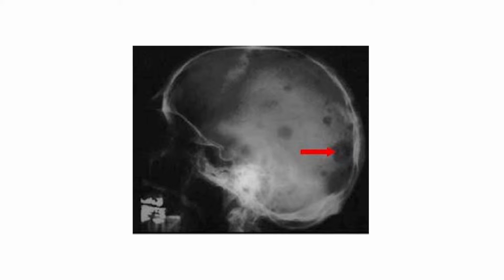So many years ago, bone survey, as it's called, or skeletal survey, was incorporated as a part of a way to see if somebody had myeloma or not. So we still do that test, and I think sometimes this is very scary for patients, part of the reason we are interested in looking at the skull is because there is a very large expanse of bone that you can look at. And so if you are looking for holes, they're relatively easier to see in that situation. It doesn't mean that there is anything in the brain or anything like that. I think that's very scary for people sometimes to think about, but it's just a good place to look for those bone changes.